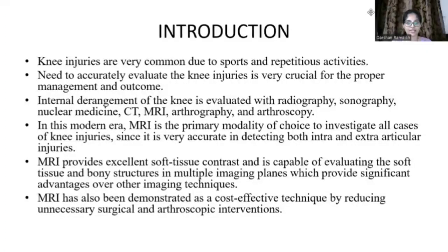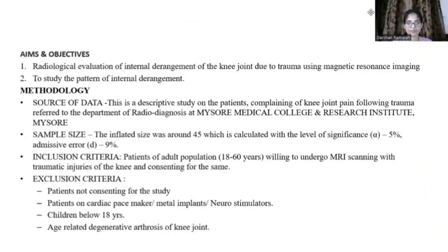In this modern era, MRI is the primary modality of choice to investigate all cases of knee injury, since it is very accurate in detecting both intra- and extra-articular injuries. MRI also provides excellent soft tissue contrast, and it is capable of evaluating the soft tissues and bony structures in multiple imaging planes, which provides a significant advantage over other imaging techniques. MRI has also been demonstrated as a cost-effective technique by reducing unnecessary surgical and arthroscopic interventions.